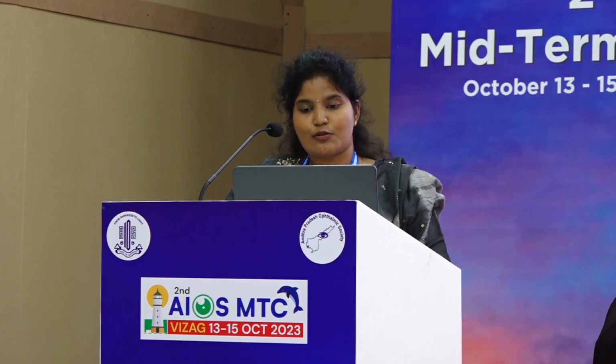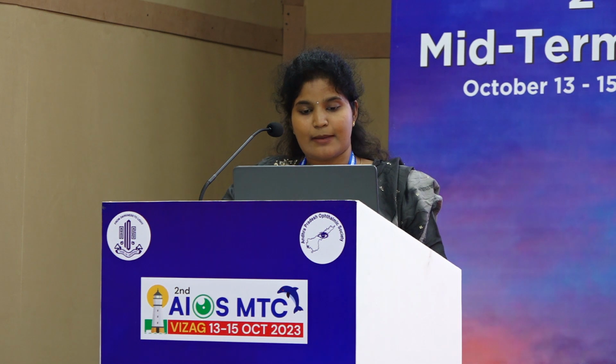Introduction. Cataract surgery is considered a refractive procedure, so estimating the intraocular lens power accurately is crucial for the refractive outcome. One of the commonly used formulas, the standard Sanders, Retzlaff and Kraft theoretical formula, introduced in the 1990s as a combination of both regression and theoretical approaches, has been found to be accurate, particularly in eyes with axial length more than 27 mm.